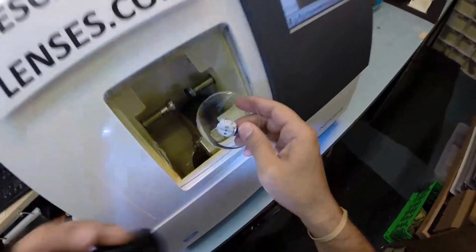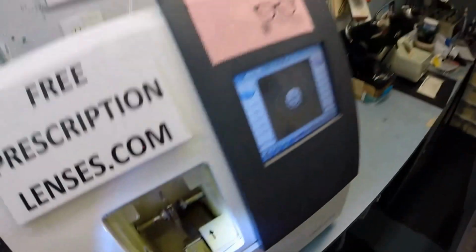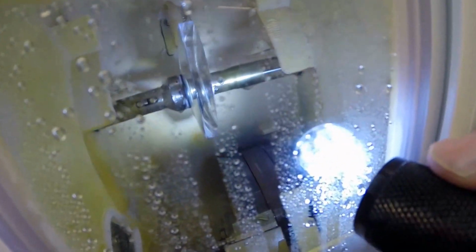I'm going to do the same thing now for the left lens. I'm going to flip that over to L. And with the magnet, hold it in place into the chuck. Thanks, Chuck. And I'm going to hit start. Again, the door closes, the clamp shuts. And then the lens is going to be traced by 2 white styluses.